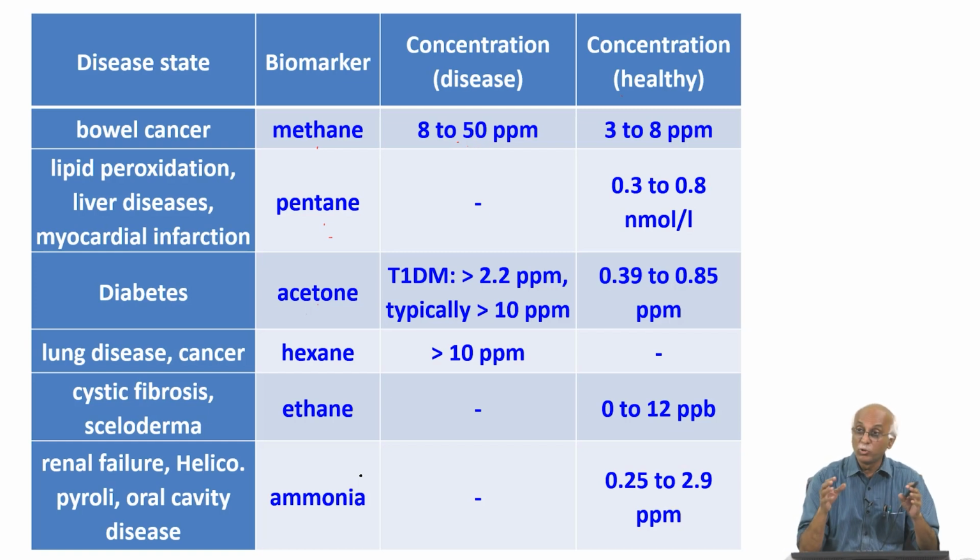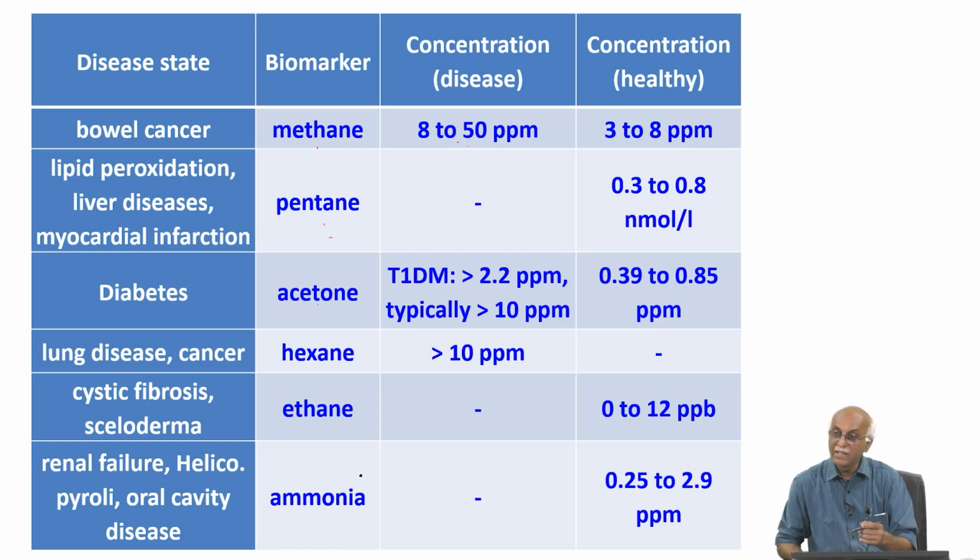It may be due to some other factors as well at that instant, but it is one of the very important indicator biomarkers. And you may need further analysis to extract these conditions, whether it is diabetic conditions or pathological conditions. That is one idea, one topic.